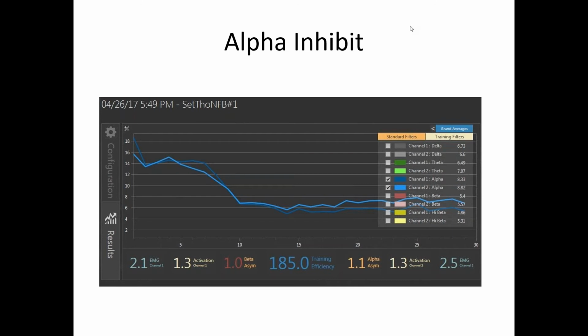No human organism could function if any of its organs would do its thing on its own without being coordinated to all others, from the heart to the cardiovascular system to breathing rhythms and so forth. And all has to be simultaneously coordinated. And one of the tools the central nervous system needs to coordinate this is physical, brainwaves. It has other tools, slower, more general tools. So if we just look at this function, then to answer your question, it would be very unlikely, if you observe a client producing any motion which is strong enough to observe, without also simultaneously seeing a previous, very slightly previous shift in brainwaves towards faster waves. Does that make sense?